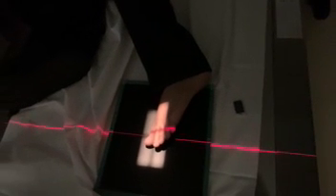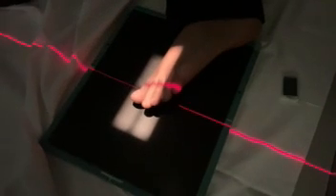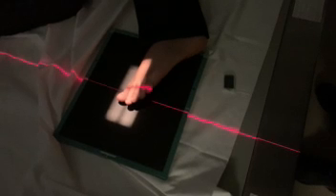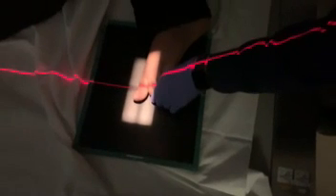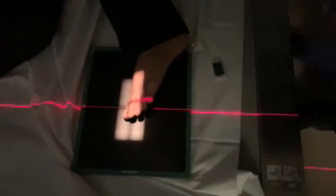So for this one, for the lateral toes, we are no longer centering at the MTP. Instead, we are going to center at either the IP for the first toe or the PIP for 2 through 5. Okay? Now, how do you get the toe by itself on a lateral? For the first toe, it's easier, right? It's easier for the patient to flex these toes. For something like, let's say, the second digit, right? Are you able to get the second digit by itself? Can you hold that position, Daniel? Yeah, right? That's what I thought.